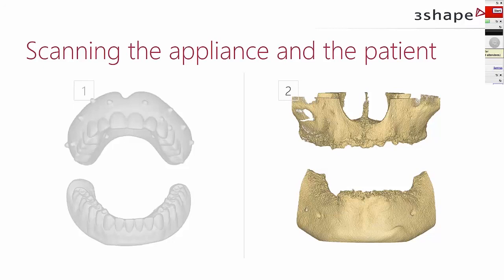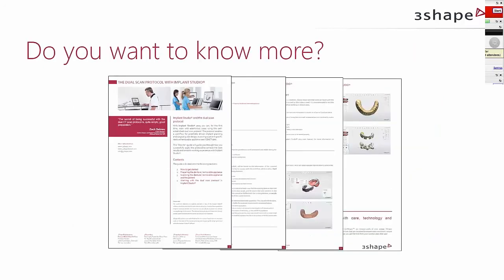But before this, maybe just for you, here we have a document we'd like to share with you. It actually summarizes what we just presented in a step-by-step instruction on how to do it. There's a quote by Zachary Dalmau, saying that preparation is key to run this protocol successfully. We can only emphasize it. It's a key element for this specific workflow.